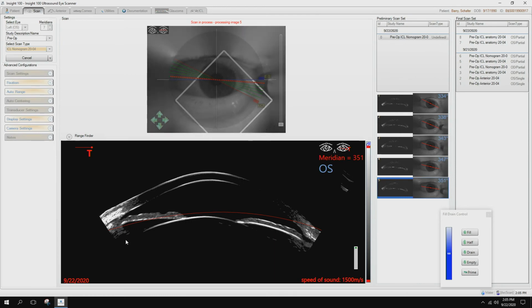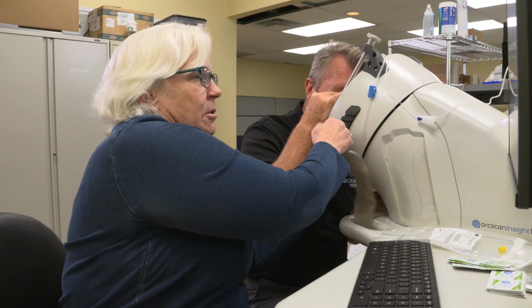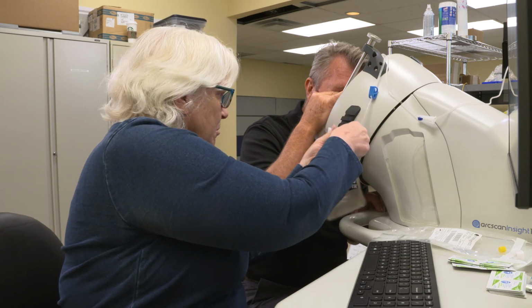Yep, it's just on the edge of it. Let me get you out of here.